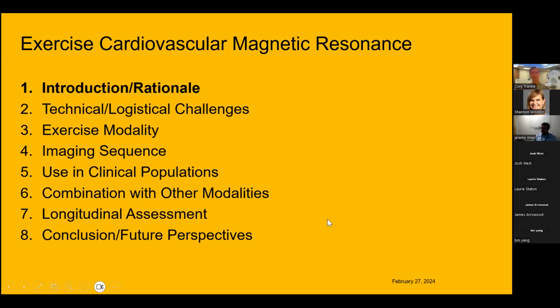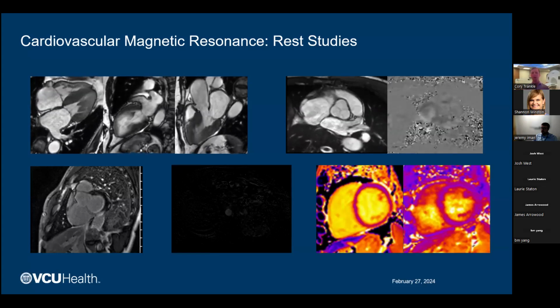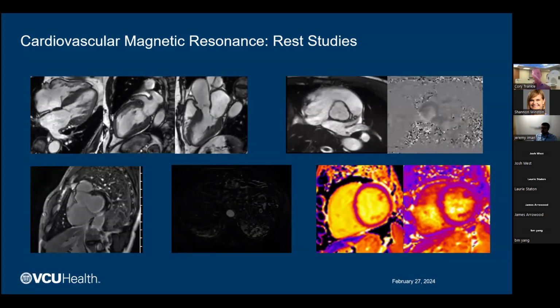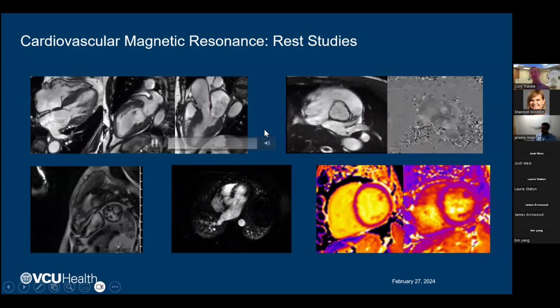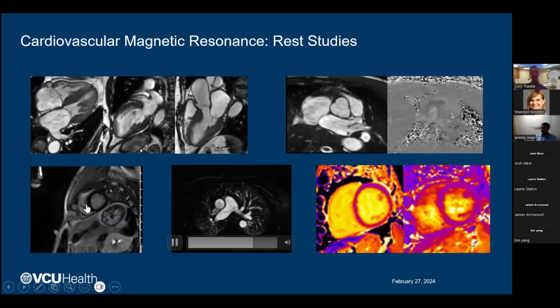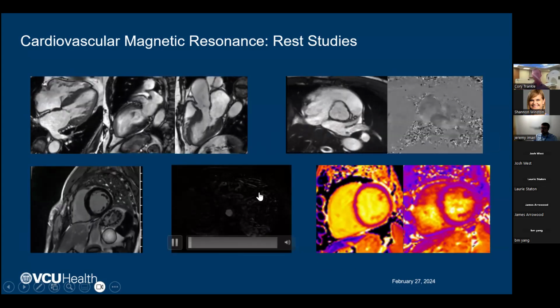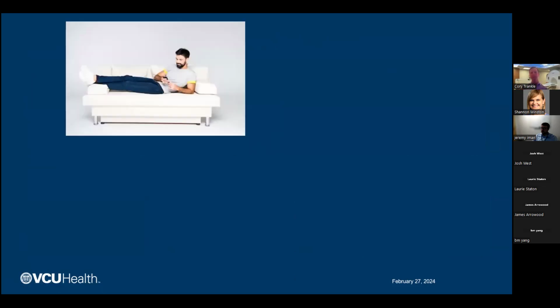And so as an introduction, we in the audience are probably pretty well aware of all the different things that CMR can do. It is such a powerful imaging modality with its ability to offer the gold standard of structure and function, EF assessment, flow assessment for valves or vessels, scar assessment with late gadolinium enhanced imaging or parametric mapping, and then of course angiography. But really, we are oftentimes imaging a patient population who has symptoms.